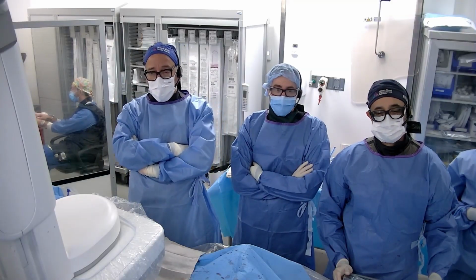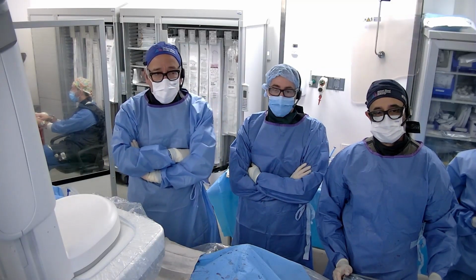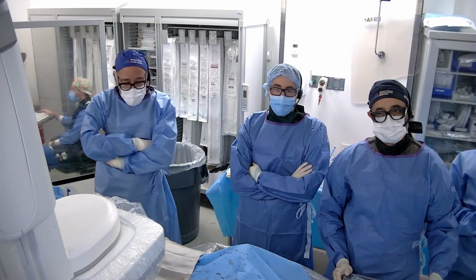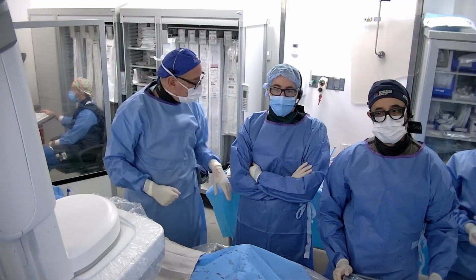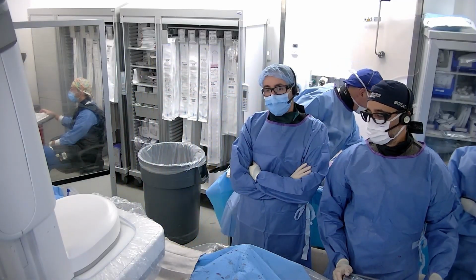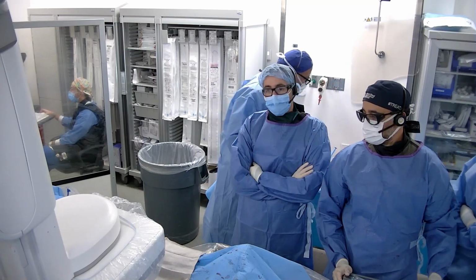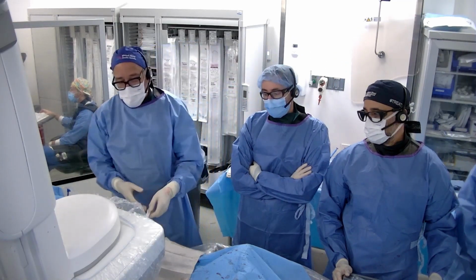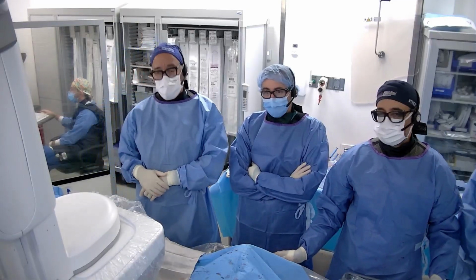If you're worried about thrombosis and things like that, we're not sure what the long-term anticoagulation capabilities are. If there's any stasis at all, I think the thrombotic risk is a lot higher. So if we can leave nothing behind, and with those dissections, maybe after you've done your prep, you can look at it again with IVUS, and if there's a flow-limiting dissection, then you do spot stenting, but a full metal jacket probably is not a great plan. Got it. All right, back to you guys.